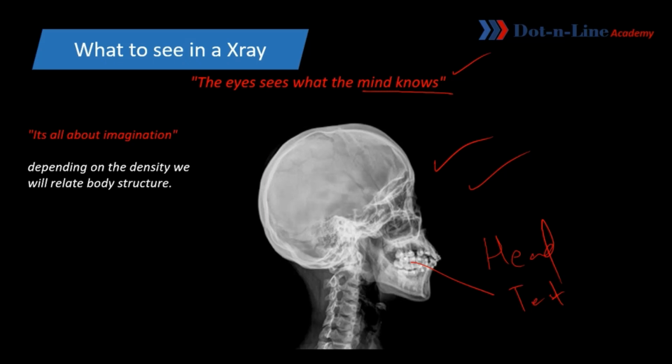From this film, you can say this is occiput, there will be eyes here. This is the foramen for eye. These are the spinous processes of the vertebral column, where the spine will be passing. It is hyoid bone. This is the apex, this is the edge of mandible.